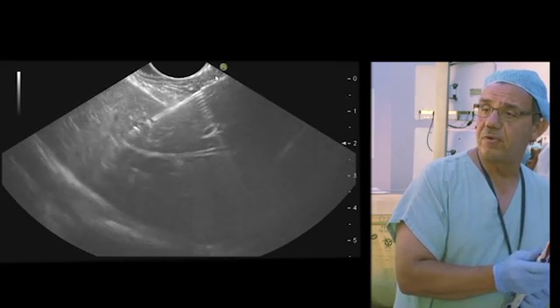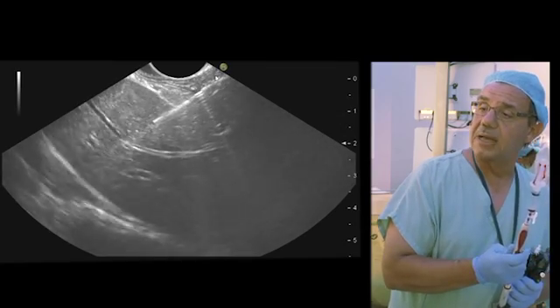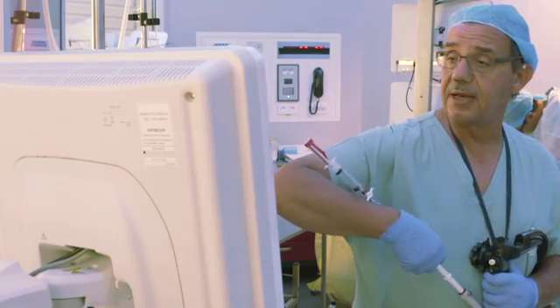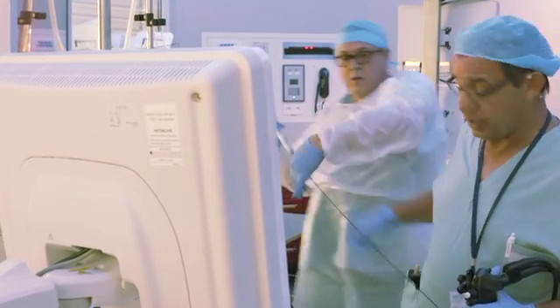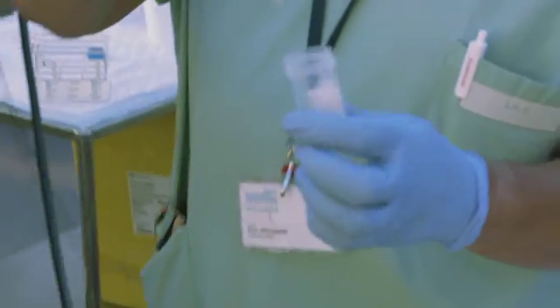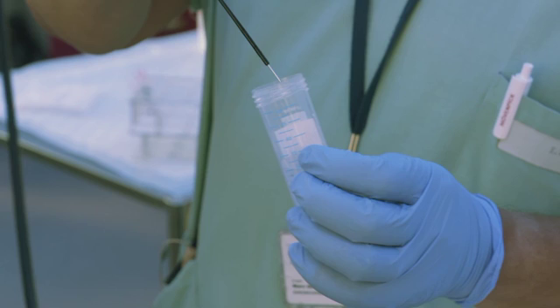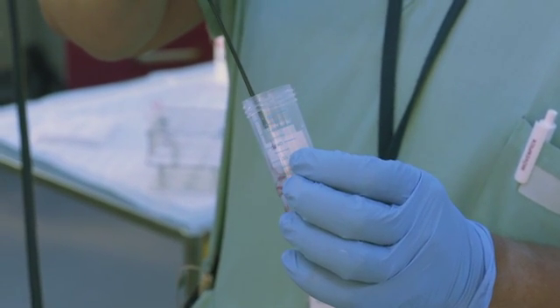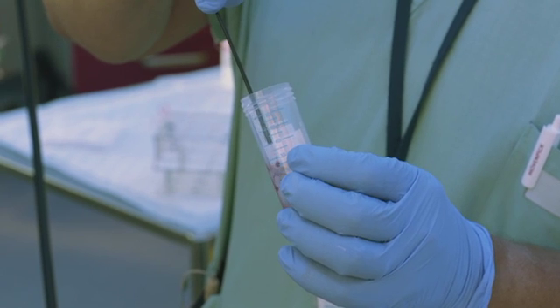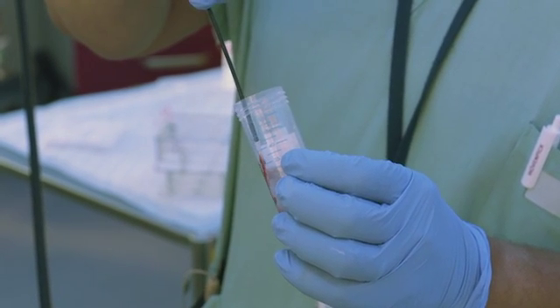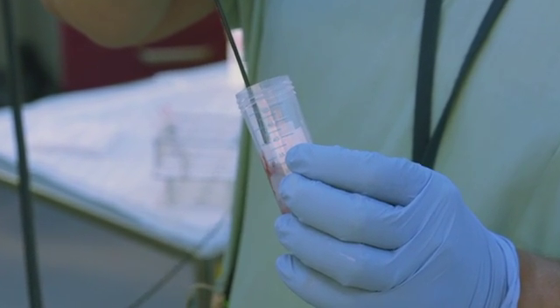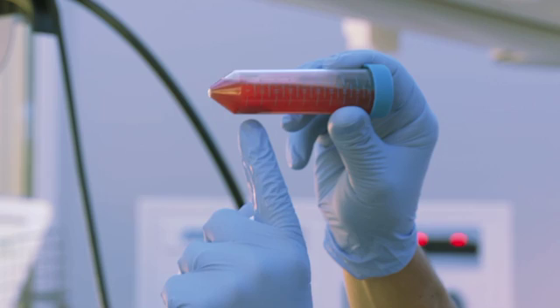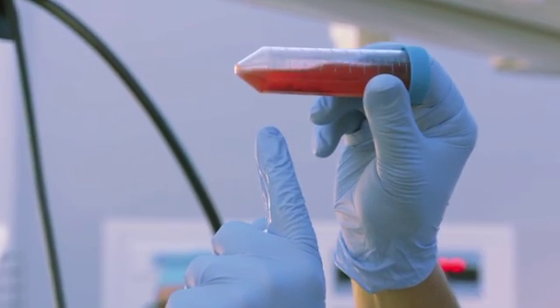I think five back and forth is enough to obtain tissue. And I think now the examination is finished. Now my co-worker introduces the stylet. We have some core here — we have some core.